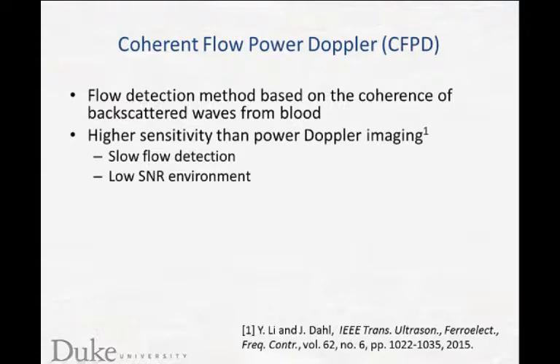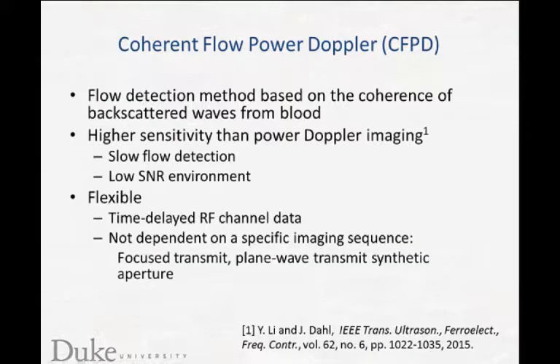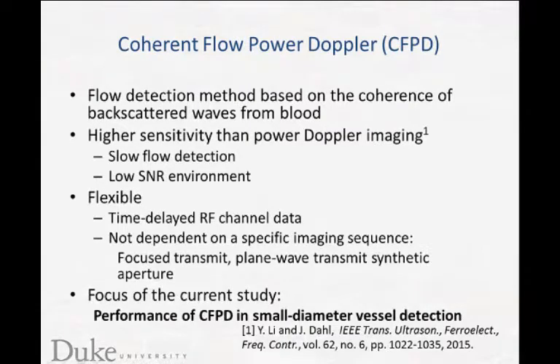In this study, we would like to demonstrate that CFPD is flexible because it uses time-delayed RF channel data, so it's not dependent on a specific imaging sequence. For example, we can use focused transmit sequence or a plane wave transmit synthetic aperture sequence. In addition, we would also like to show the performance of CFPD in small vessel detection.